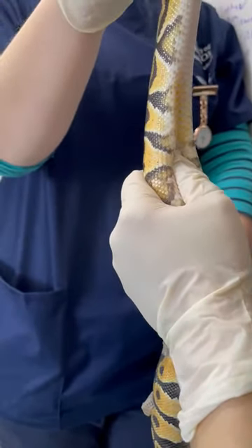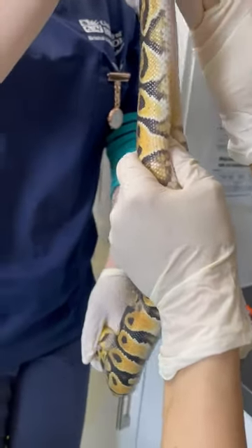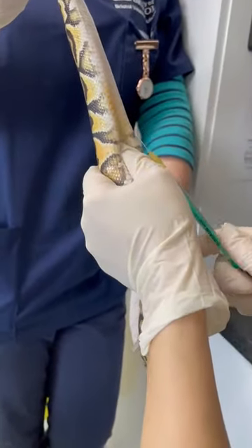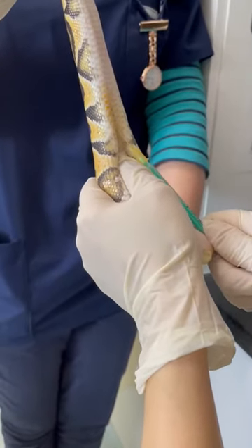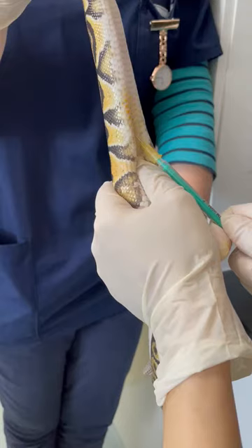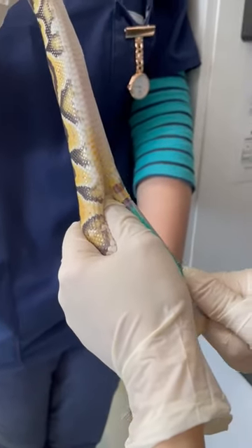Then we take our needle and syringe and if we just flatten him a little bit like that. You're entering at about a 45 degree angle between the scales, and then just gently drawing back until you get a blood flow.